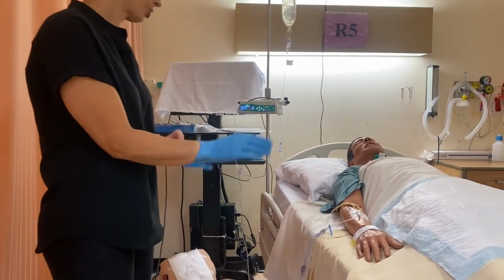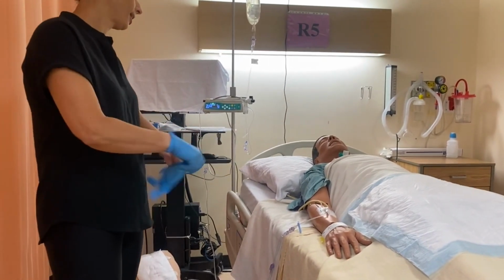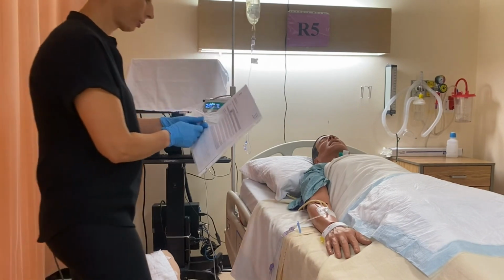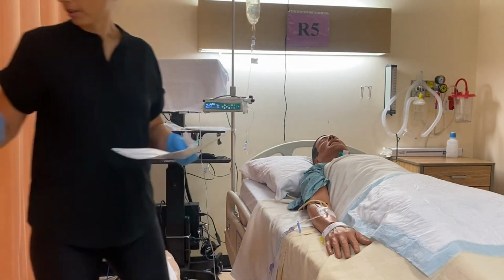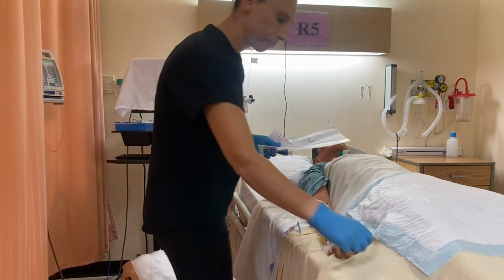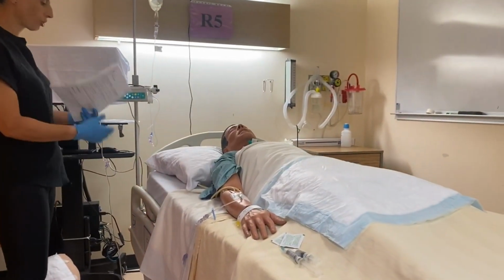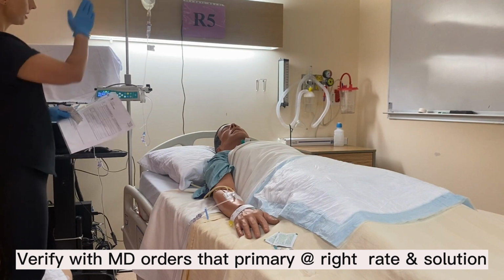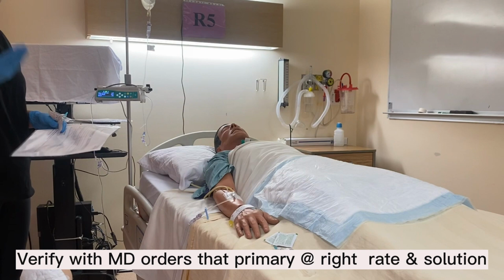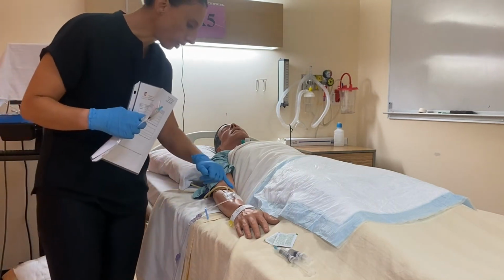And I'm going to approach my patient's room. Knock, knock, knock. Hello, I have your morphine for you. Is it all right if I come in? And I'm going to come in with my MAR. And I'm just going to grab a flush here as well, and some alcohol swabs. Okay, so because this is a running IV, I'm going to check to make sure with my MD orders that it is the right IV fluid, and also that it's running at the right rate, and that is correct.